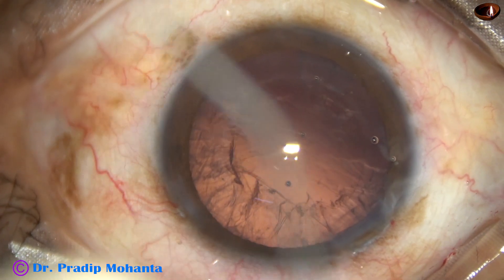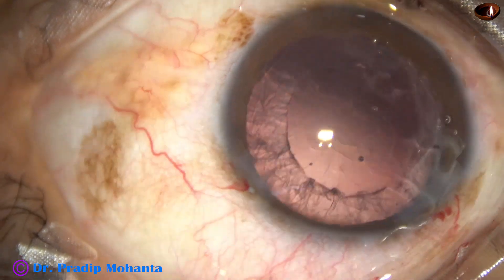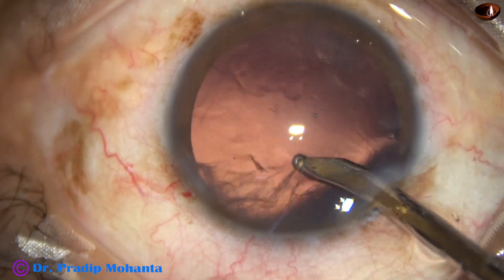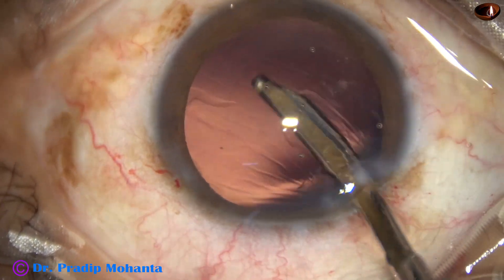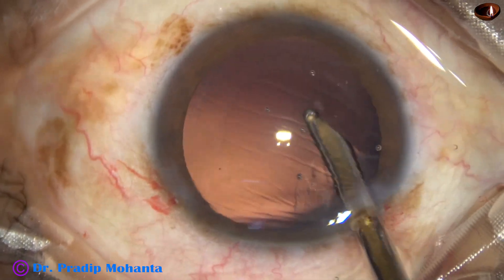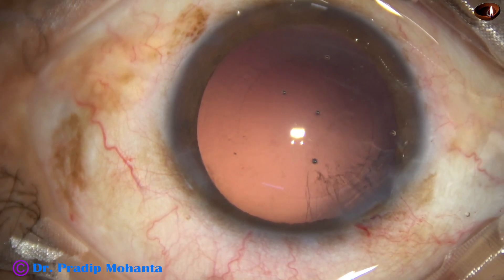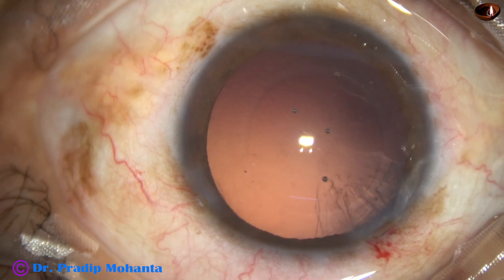Now some visco is injected to fill up the anterior chamber and the capsular bag. Cortical cleanup is to be done now. I have only one side port and I use a Simcoe cannula to remove most of the cortex through the main wound. The anterior chamber does not become shallow because it is a 2.8 millimeter wound. The anterior lip of the wound is lifted up. There is visco and the side port is small, so I am going to use bimanual irrigation-aspiration for removal of the sub-incisional cortex.